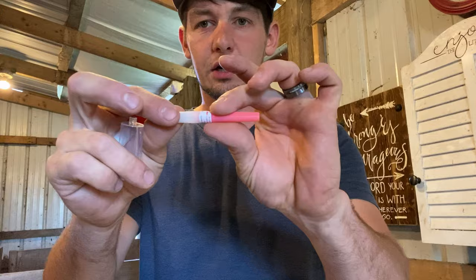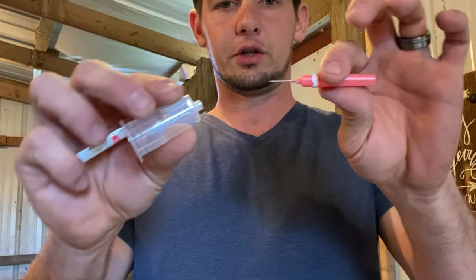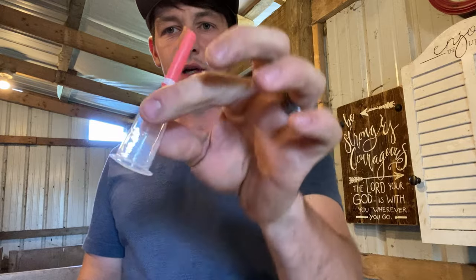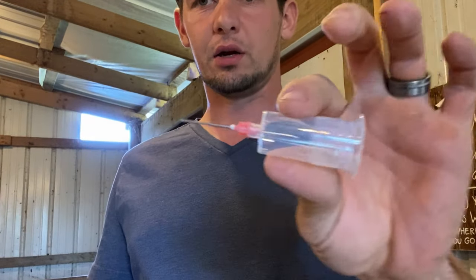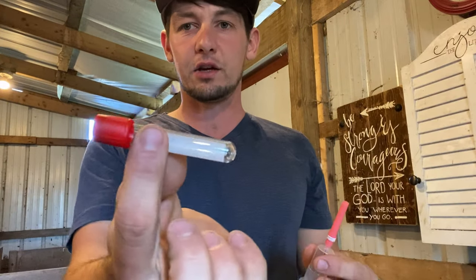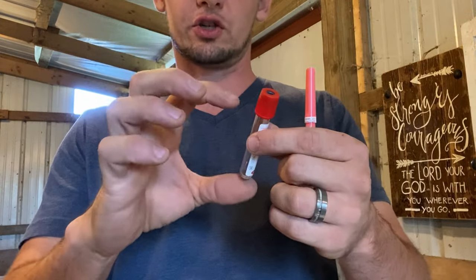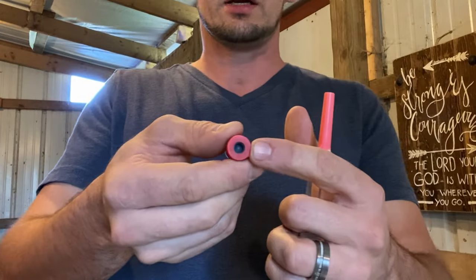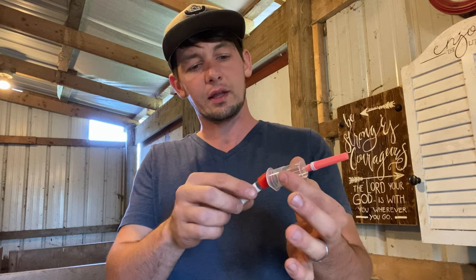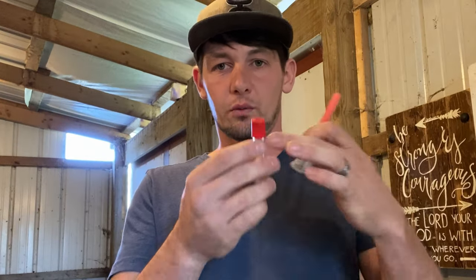So first thing, you've got this needle here. Going to take the cap off, and that leaves you with a needle with some threads at one end. Just going to thread that down into this needle holder. You've got a needle inside of there, and once you pull this cap off, you've got a bigger needle on the outside. The bigger needle is what's going to be stuck into the cow to hit the vein. There's actually vacuum pressure inside of there, and it's got a rubber piece right here at the end. I'm going to stick the needle into the cow — the artery — and then once I hit that artery, I'm going to stick this vacutainer up inside there. The needle inside is going to puncture it and the blood will flow in.